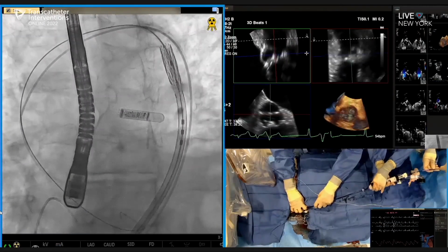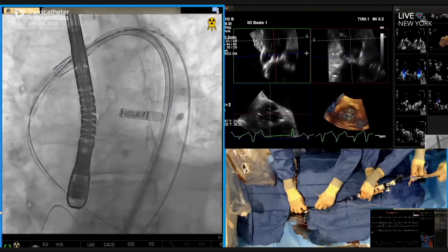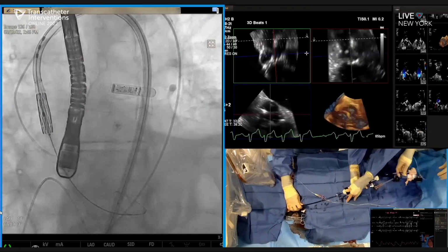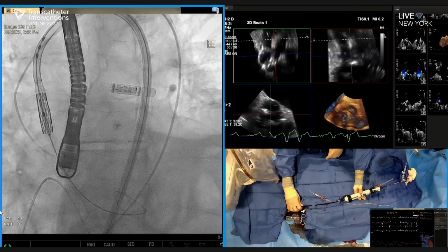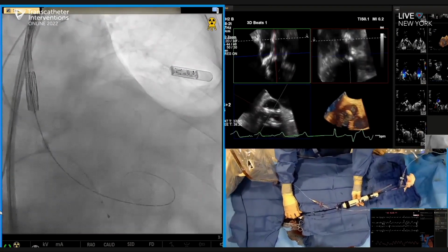The other thing that we never discussed earlier is that we're going to flex here, pull the wire, make sure we don't touch the arch. We're going to go back into our view before we cross. The one thing we didn't discuss is this anomalous circ. And, Torsten, we've always sort of theoretically talked about it. Any concern that you pinch the stent or the artery?